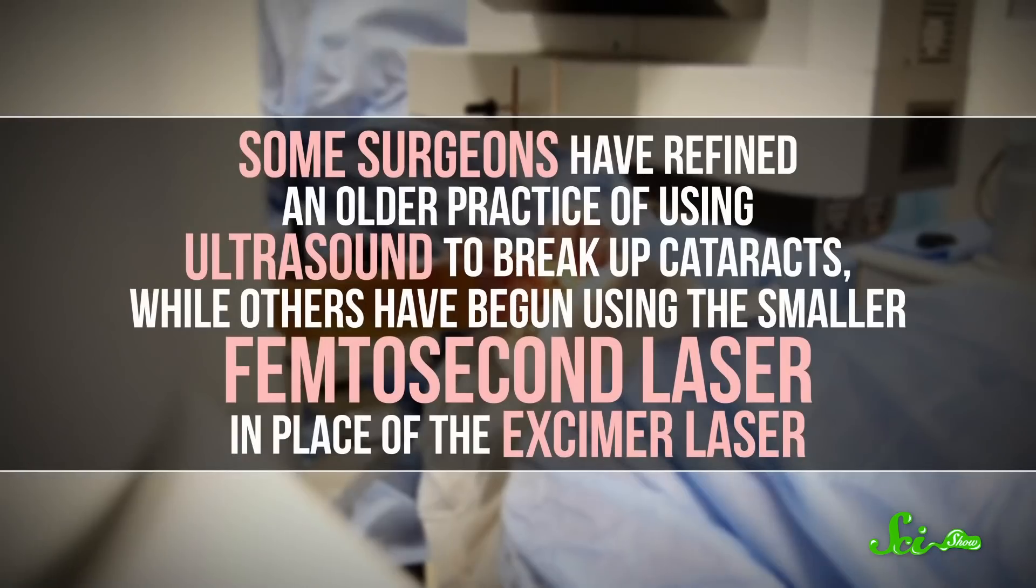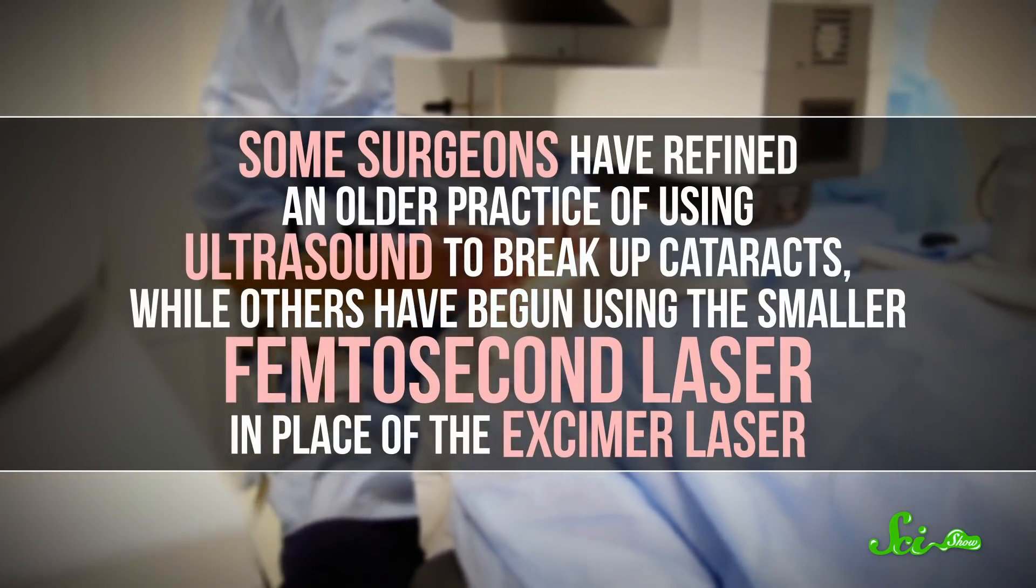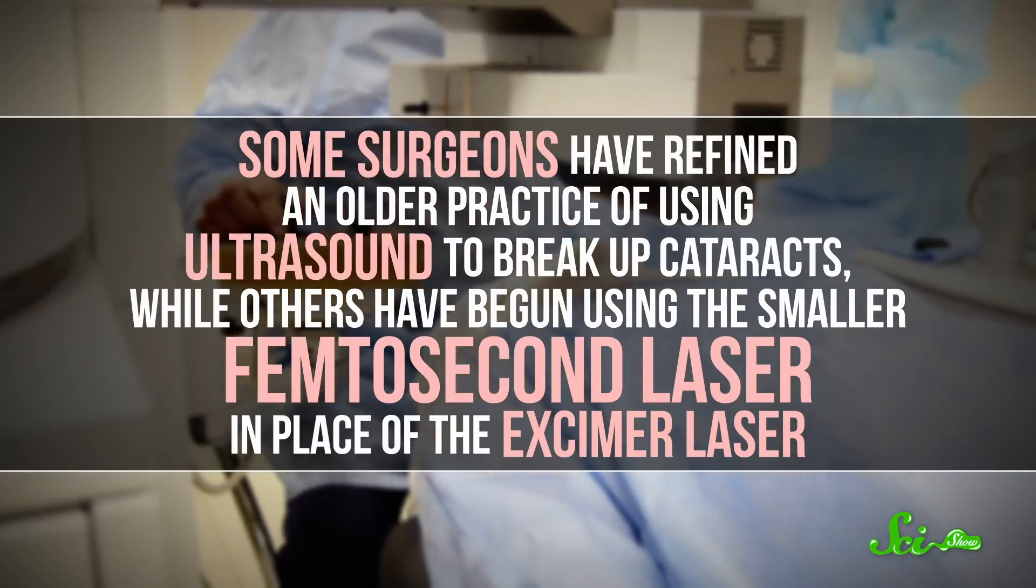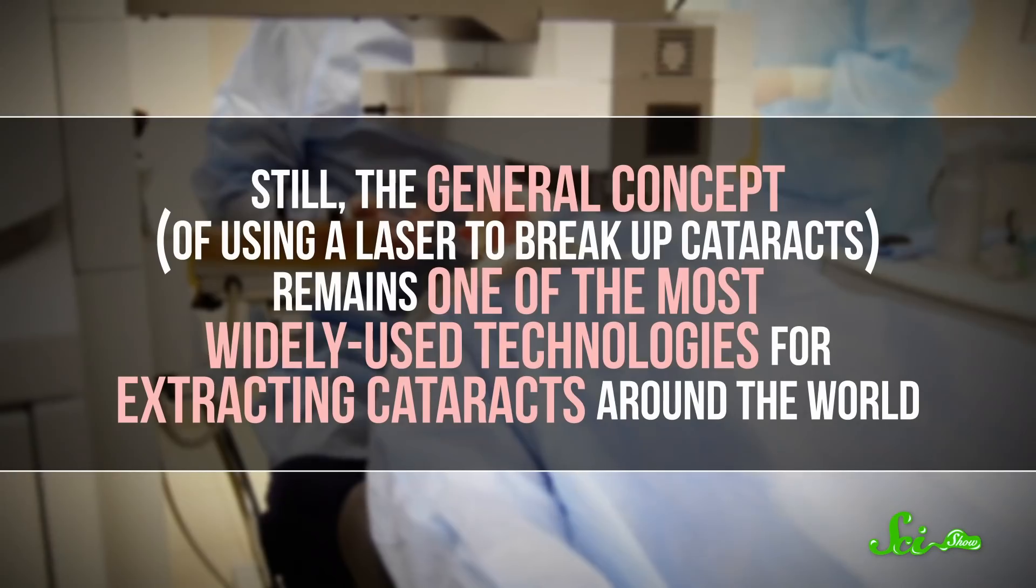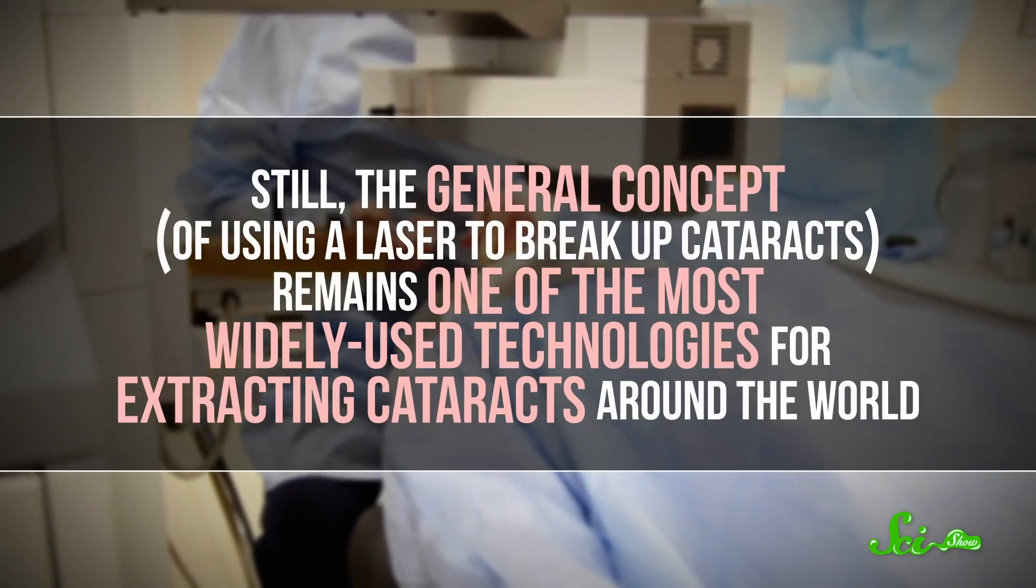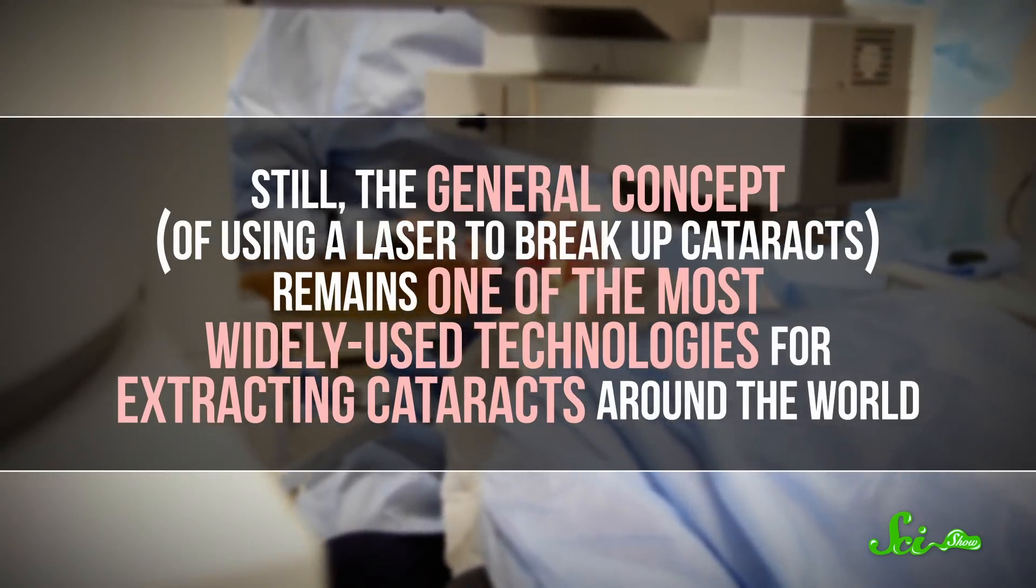Since then, technology has continued to advance. Some surgeons have refined an older practice of using ultrasound to break up cataracts, while others have begun using the smaller femtosecond laser in place of the excimer laser. Still, the general concept of using a laser to break up cataracts remains one of the most widely used technologies for extracting cataracts around the world.